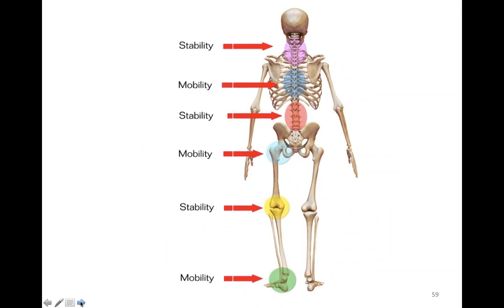So within our course, we take this approach. We go through a divided highway. We talk about the idea of joint by joint and what areas need stability and what areas need mobility and how we can affect that with our tools. And then we also talk about fascia as our highway. How can we create some information to our fascia, which will lead to information to our brain?